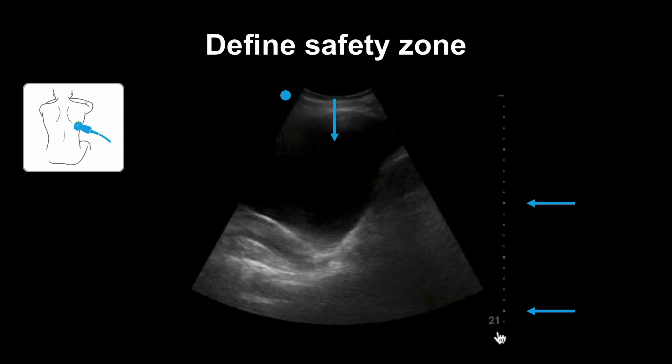On the right, you can see the measurement marks of the ultrasound machine screen. This is set to a depth of 21 centimeters. This tick here, with the second blue arrow, is showing 10 centimeters. This would be a good idea of how deep your needle can go in before it hits crucial structures.